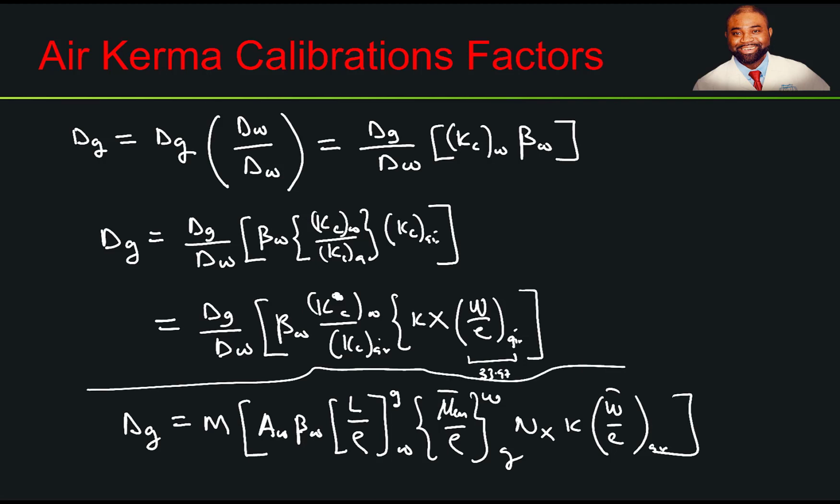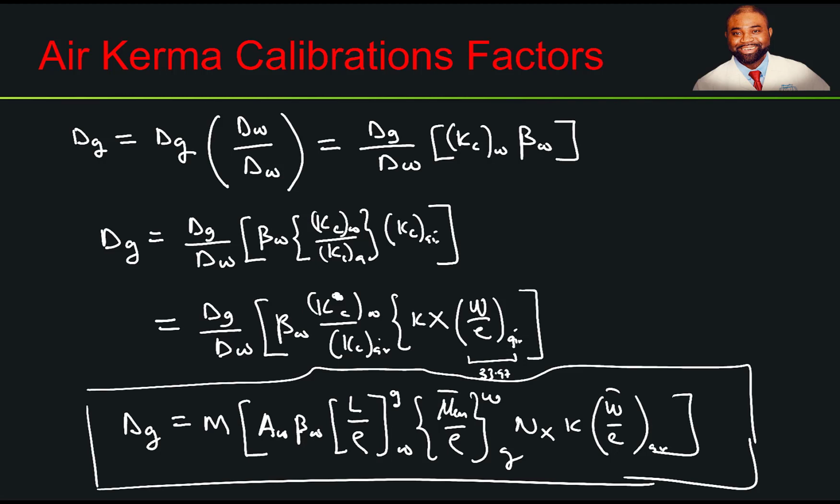This gives us the dose to the gas. If you further simplify this equation, you'll end up with this equation.